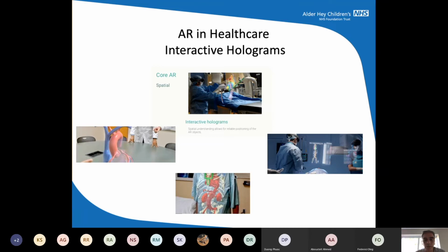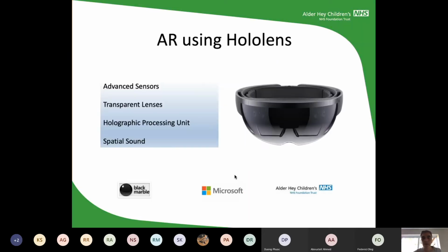with a particular patient. For me, the idea was, if I'm operating or doing an intervention, how can I superimpose that on the heart, and it gives me straight away the 3D image that I have in my head, live, so that it is reproducible. So if I am a new surgeon who doesn't have the experience to see all these things, I can accelerate the learning curve, if you want to call it that.